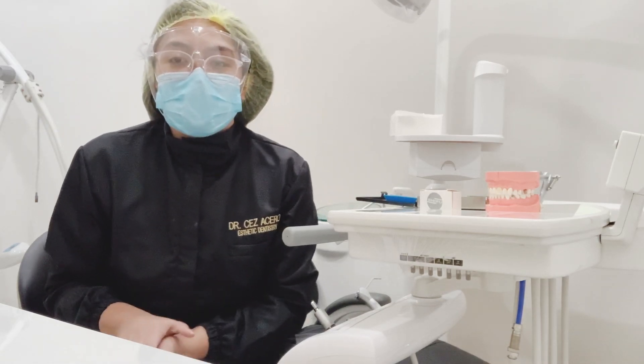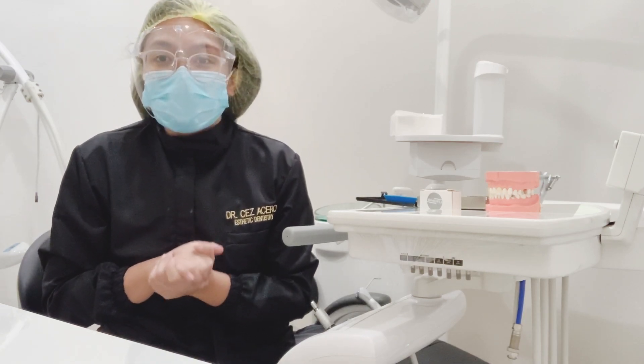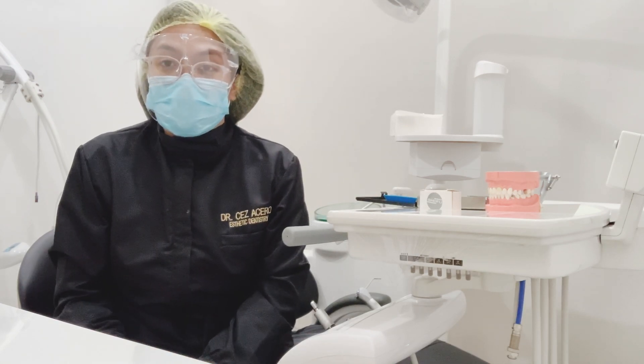Hi everyone, I'm Dr. Zez Acero from the National University College of Dentistry, Restorative Dentistry Department. Today I'm going to teach you how to do a Class 2 amalgam preparation.